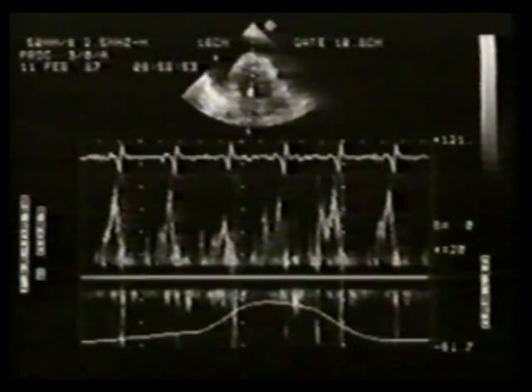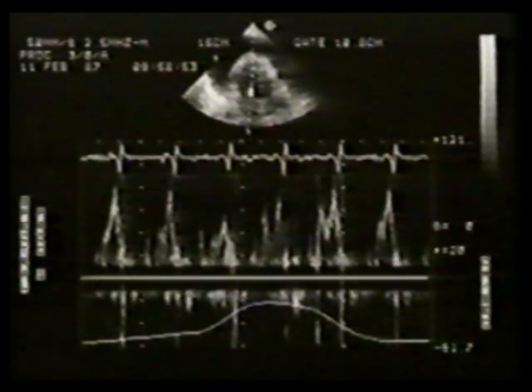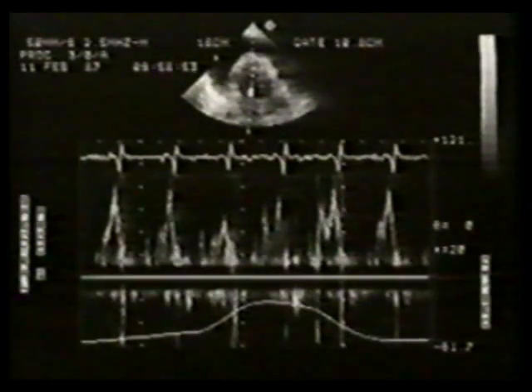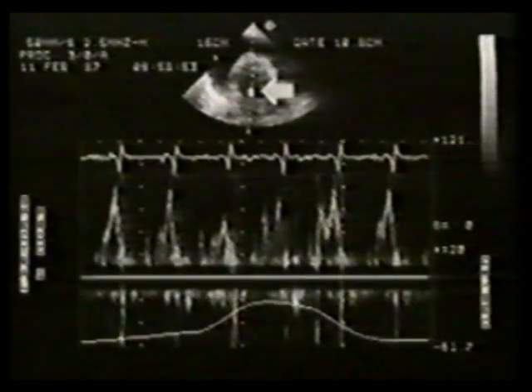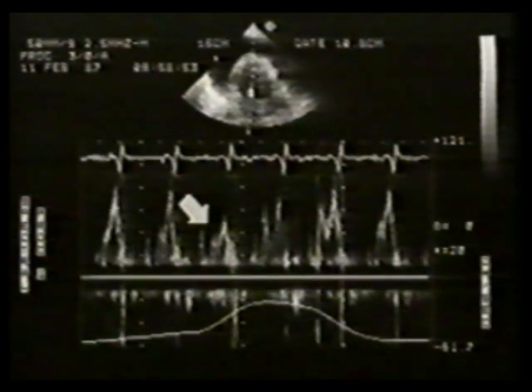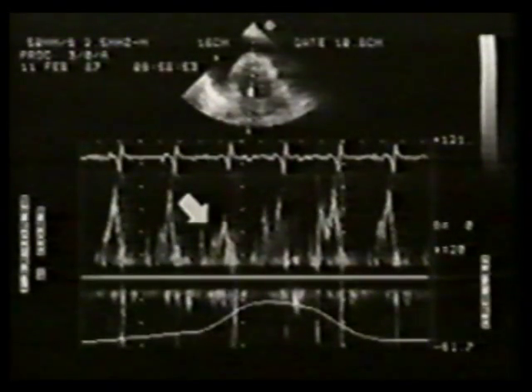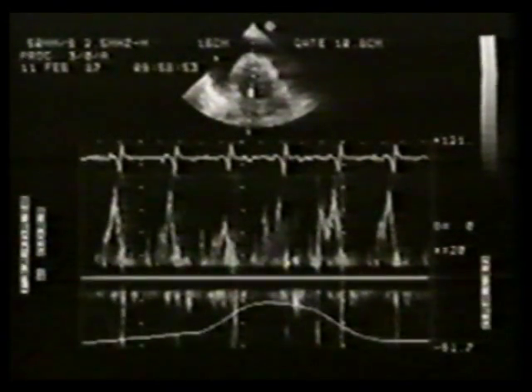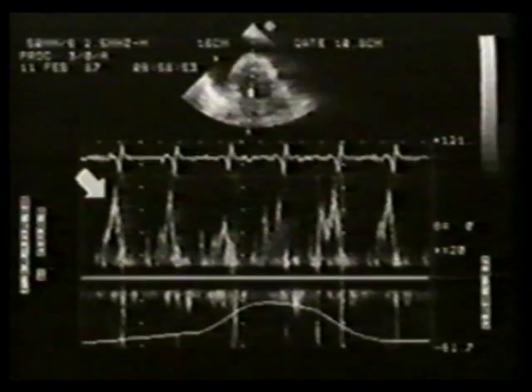One of the characteristic abnormalities with tamponade is a decrease in the mitral flow velocity with inspiration. The pulsed wave sample volume has been positioned between the tips of the mitral leaflets. The mitral velocity profile decreases with the first beat of inspiration. Compare the size here with the first beat of expiration or with end expiratory apnea.